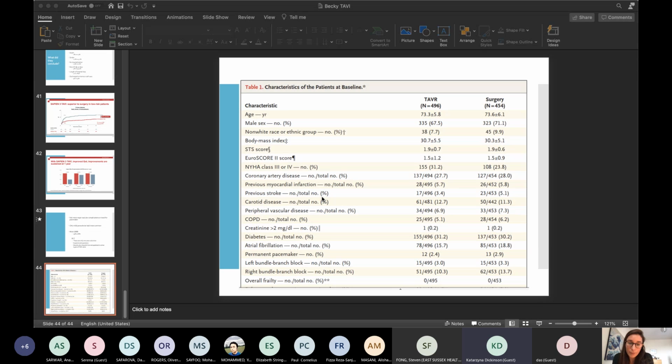And the other comment about the TAVI in TAVI, or TAVI in a previously replaced tissue valve, is that it is becoming an increasingly common procedure. The data for that isn't as great as we would have liked, but a lot of it, as Becky said, is based on anatomical circumstances. Some patients who already had a valve will have a valve which is slightly mismatched to the original valve. So you have a mild degree of stenosis, even if you don't consider the actual narrowing within the cusps of the valve.